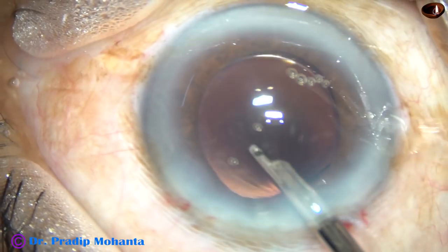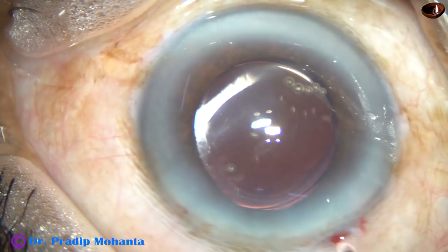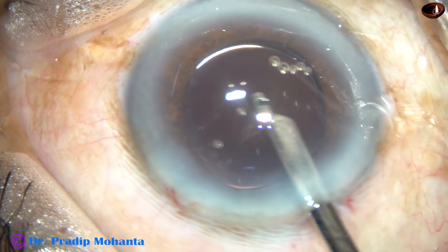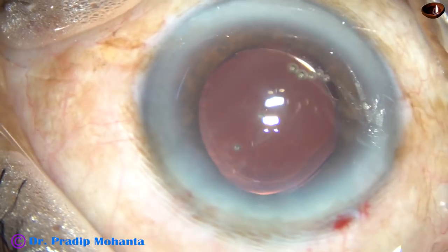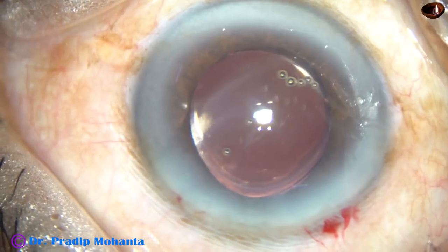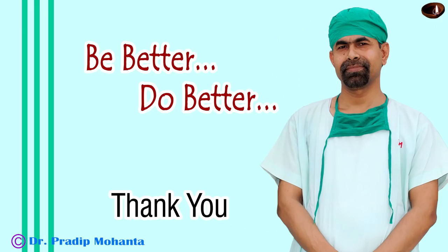This is the final lavage of the anterior chamber. We are towards the end of the surgery — the anterior chamber is nicely formed and the case is concluded. The integrity of the wounds is checked. Thank you very much for watching. Hope this video will help you in developing your surgical skills — wish you were better.